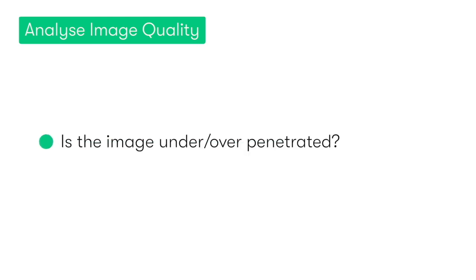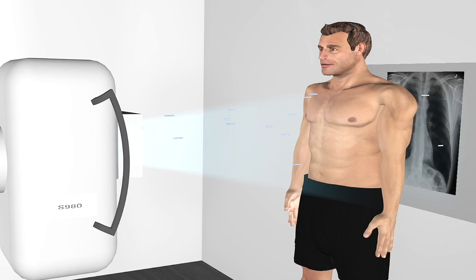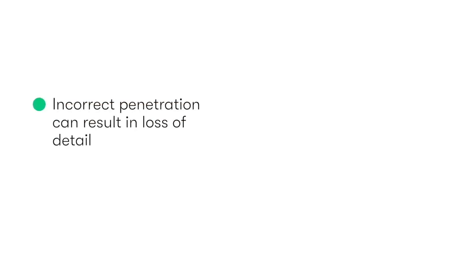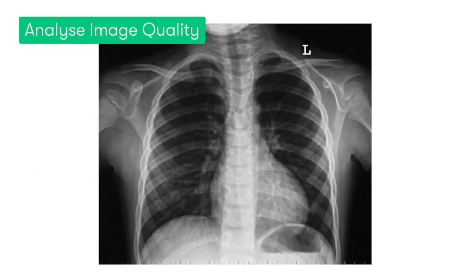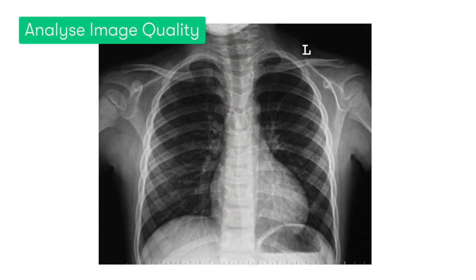Lastly, we want to check to see if the image is under or over-penetrated. Penetration refers to the degree that the X-ray beams have passed through the body. If the general penetration of the X-ray is less than necessary, it can lead to a poorly exposed image in which we have significant loss of detail. Now, with modern digital X-ray machines, this is definitely much less of an issue than it used to be, but it's still really important to check. In a well-penetrated image, the vertebral column should be visible just behind the heart, which, as you can see, is definitely the case in our image.